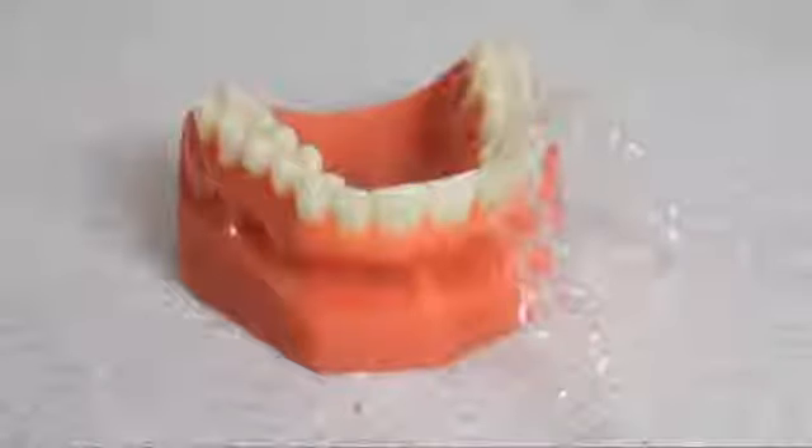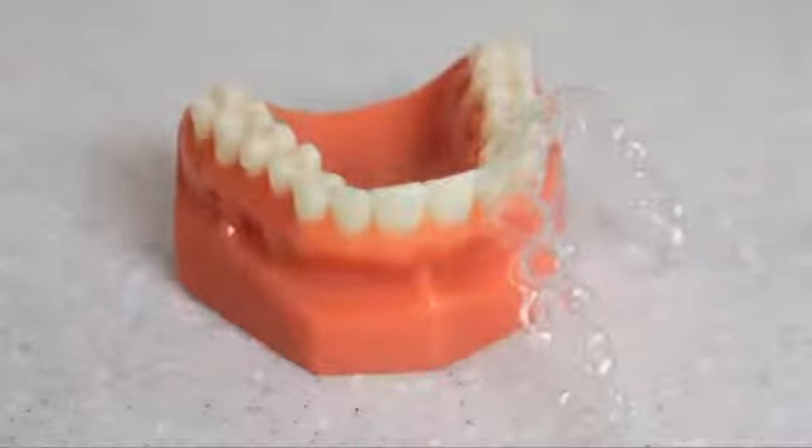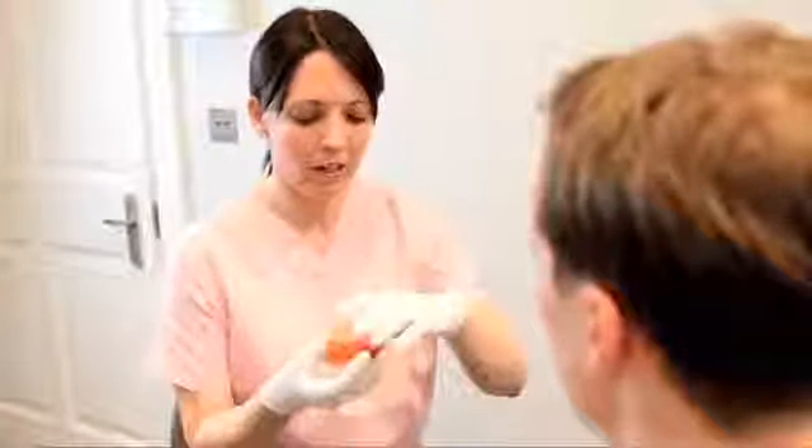Clear braces have revolutionised the way that teeth are moved, and with this comes a whole host of new challenges and points to consider. Ideally, the brace needs to be kept in the mouth for 22 hours a day and should only be removed for the intake of food.